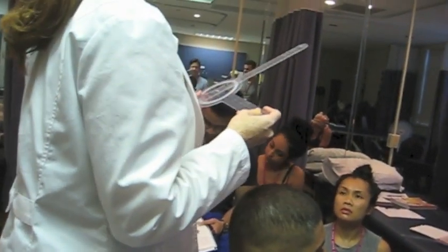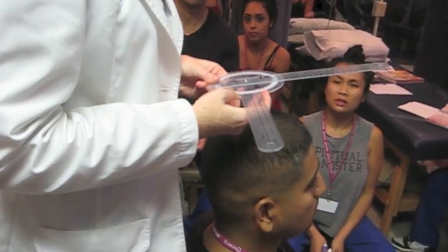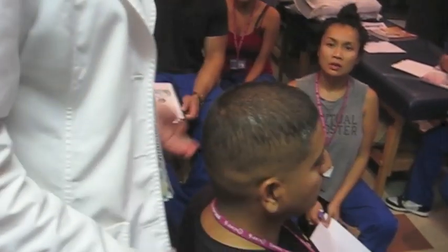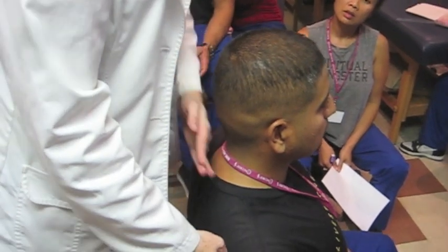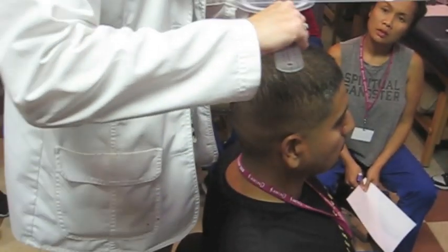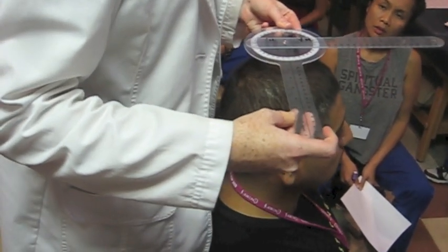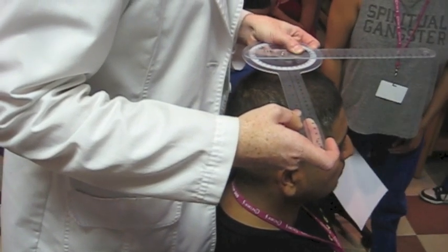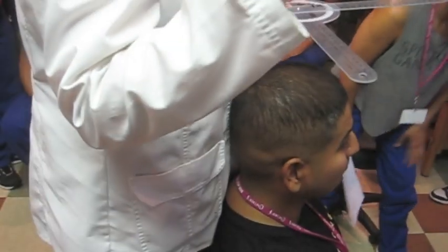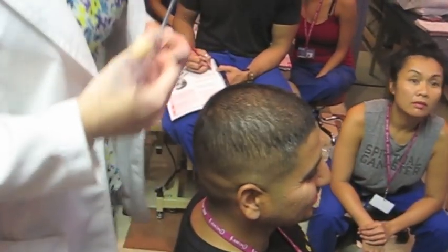And what is our stationary arm? An imaginary line with the acromion processes. So I'm going to come back here, palpate my acromions, and imagine a line straight across here. Now it's not going to be totally in line with it — it's just going to be parallel to that line. And then where is my moving arm going to be? In line with the nose. That's why I have to be up this high so I can see.